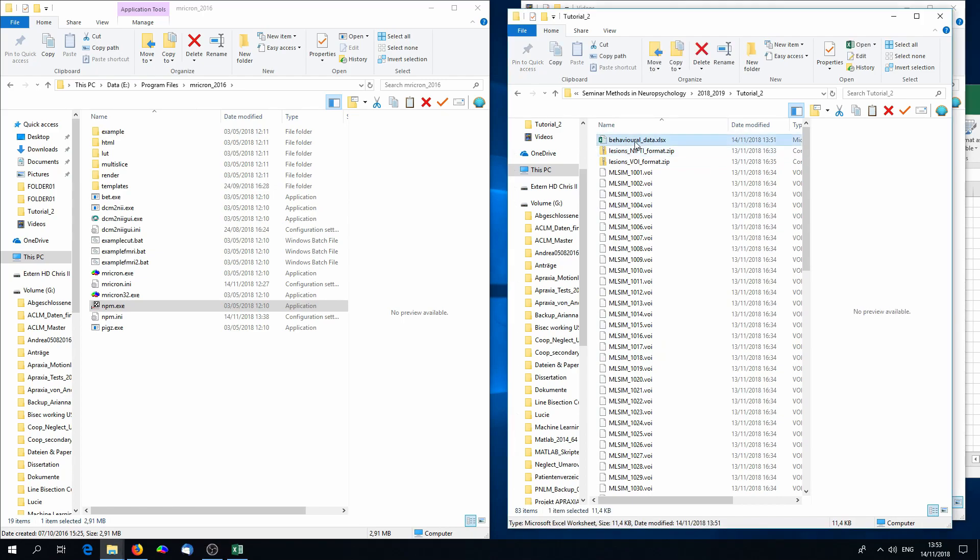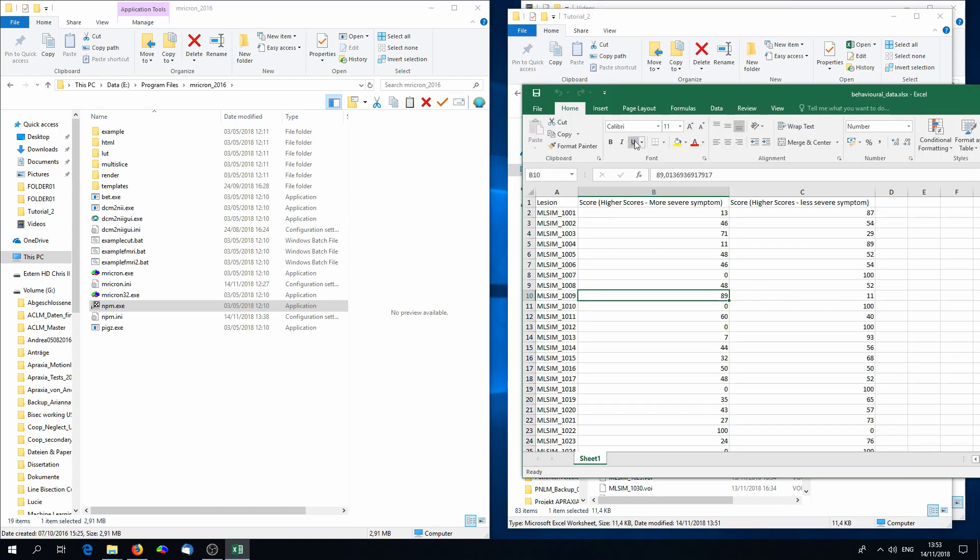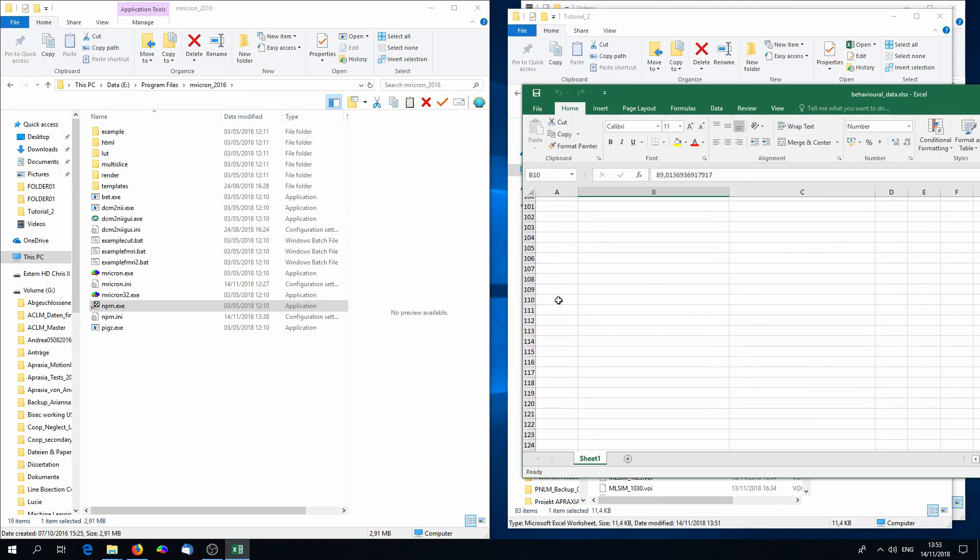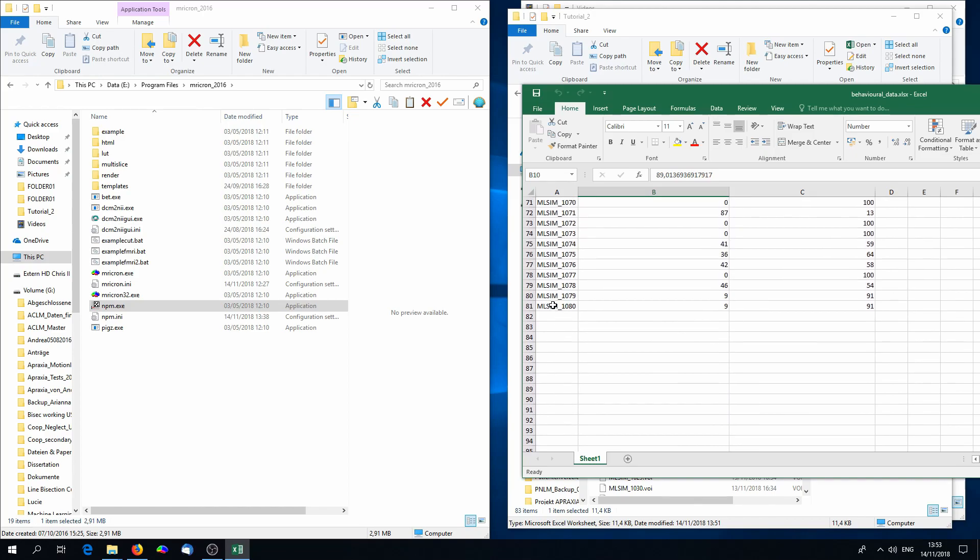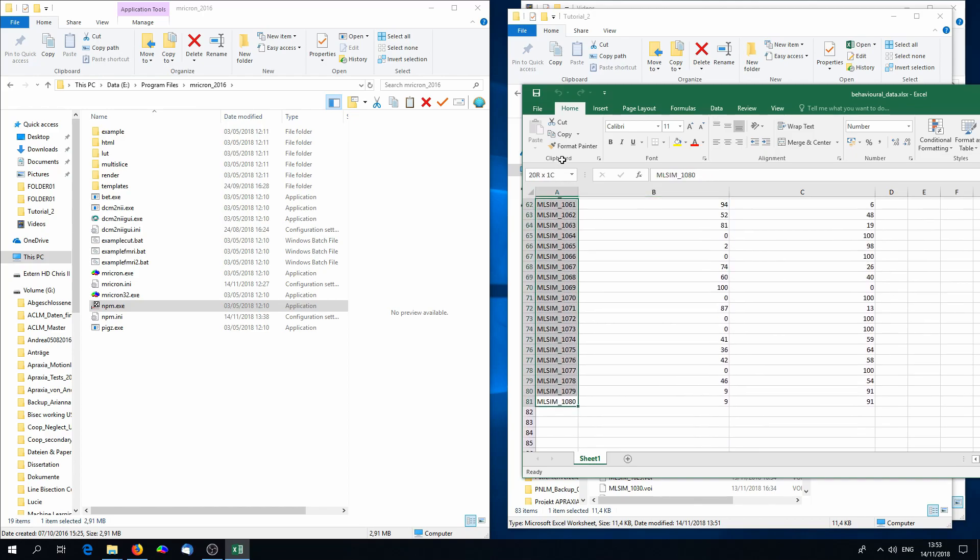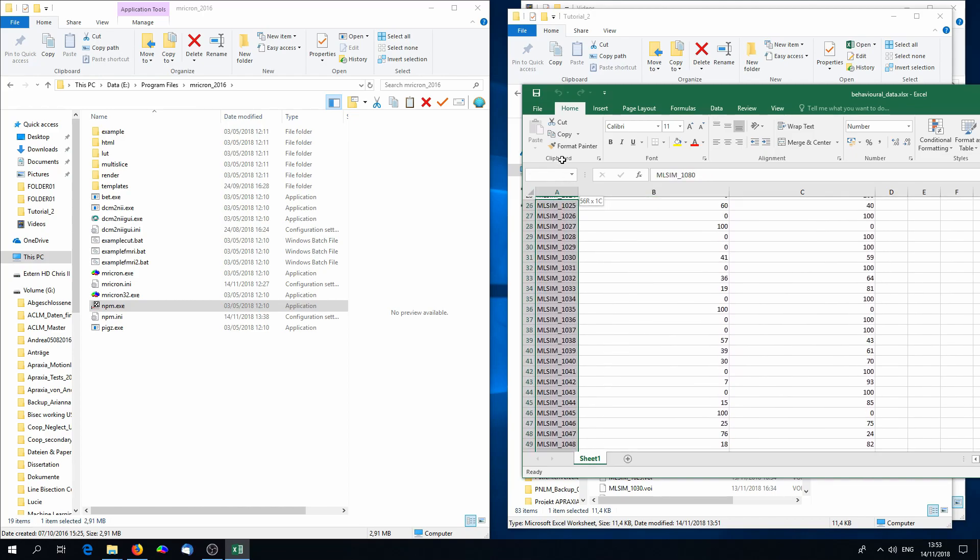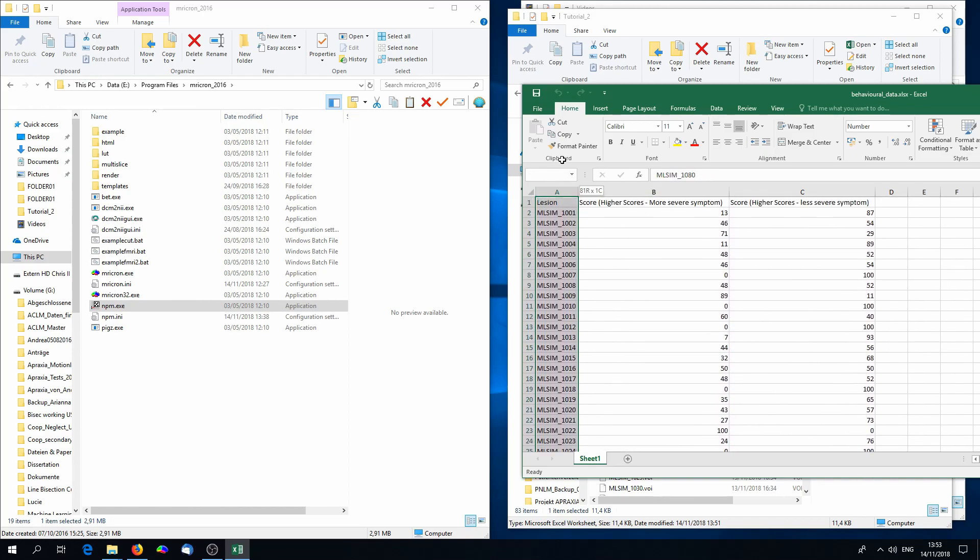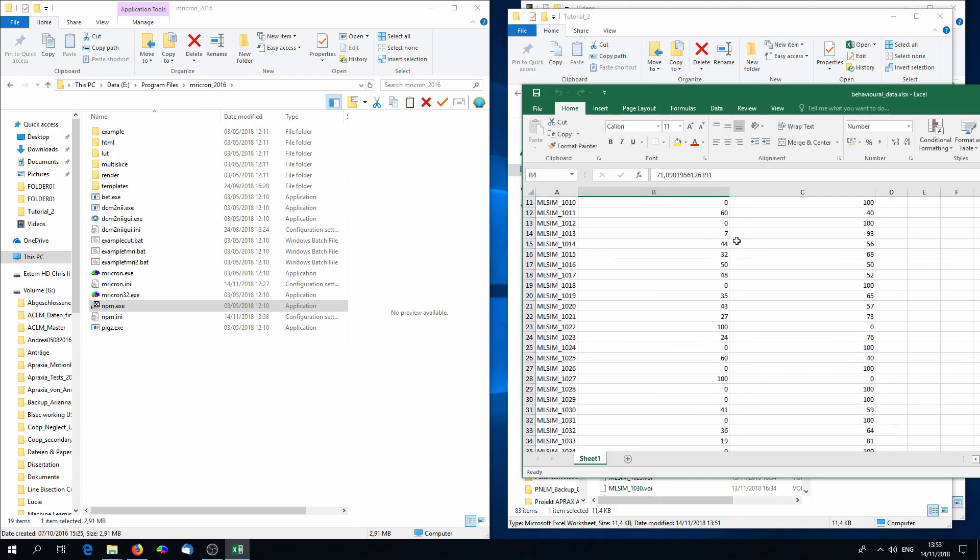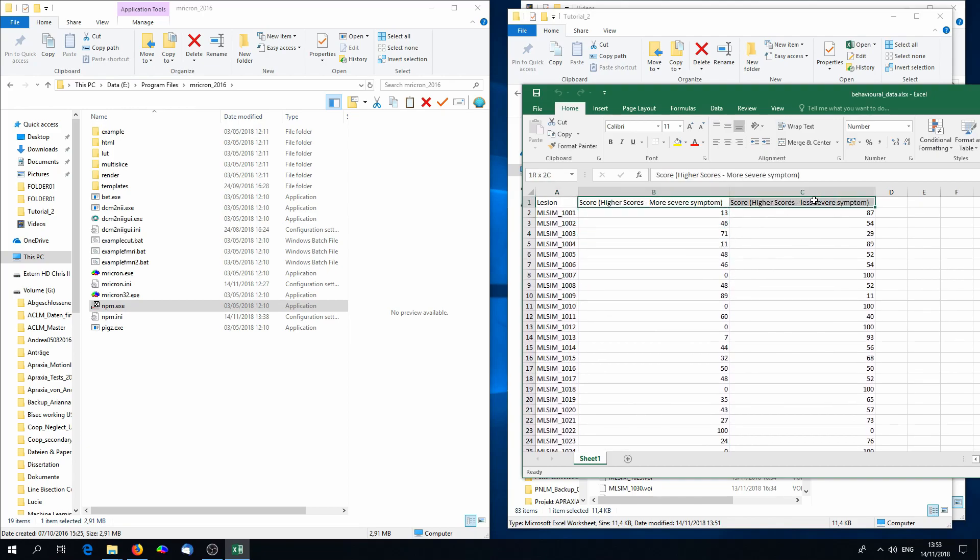The last thing we need are behavioral data. If you look into the Excel file, you will see that there are 80 lines for each lesion, one line, and there are two columns of symptoms. The symptom scores here are actually the same, just inverted, with a maximum score of 100.